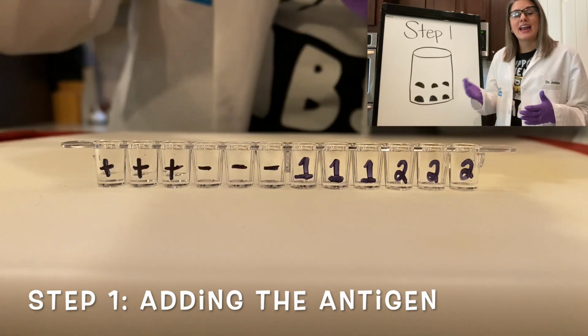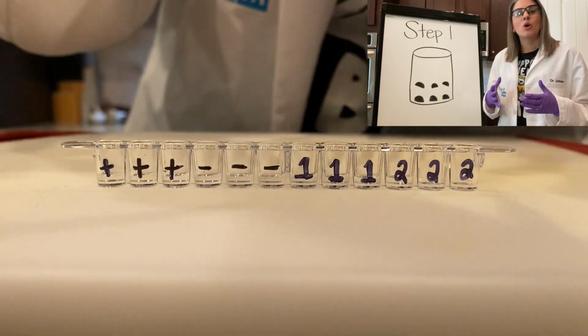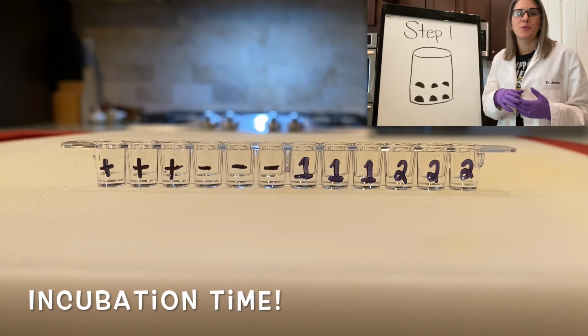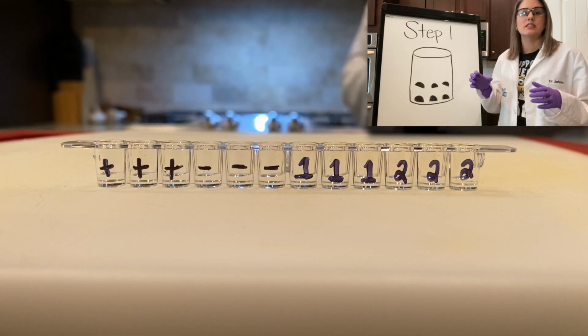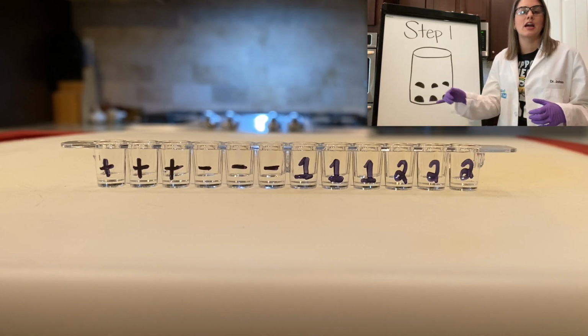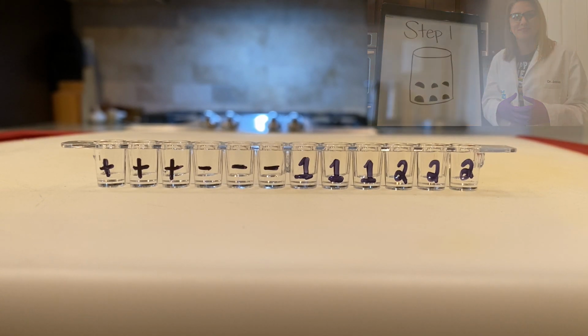For step 1, we're gonna add antigen to all 12 wells of our testing container. Remember, we have to provide the antigen in order for the antibody to bind to. And so we're gonna give it 5 minutes to incubate. And basically that's allowing enough time for the antigen to stick or attach to the surface of the polystyrene well. And it does this through hydrophobic interactions.